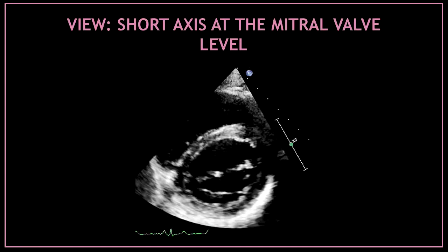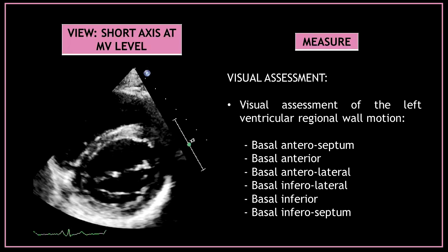Now let's move to the parasternal short axis view at the mitral valve level. After obtaining this view, do a visual assessment of the left ventricular regional wall motion. At this level we can only see basal segments of the left ventricle, so assess for any regional wall motion abnormalities of the basal anteroseptal, basal anterior, basal anterolateral, basal inferolateral, basal inferior, and basal inferoseptal segments.